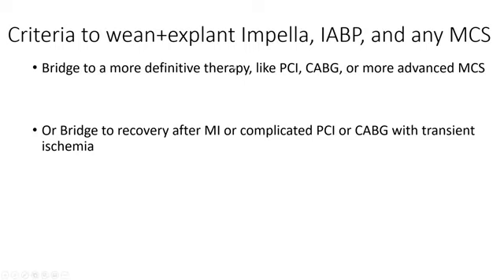You're trying to stabilize the patient before more definitive therapy, including bridge to an implantable LVAD or to transplant. Or they could be bridge to recovery after MI or complicated PCI or CABG. So in the latter, the patient is hemodynamically unstable, you did your PCI, you expect the patient to recover within a couple of days, and you're putting that balloon pump to support him while his LV is recovering, okay?